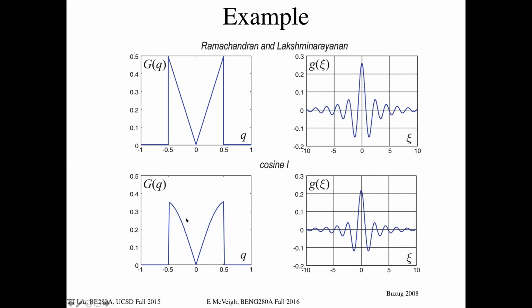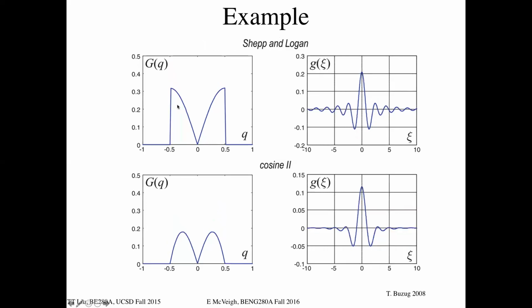However, to make the pictures look a little bit smoother, more appealing, oftentimes these high frequencies aren't amplified as much. You sacrifice some resolution, and you just tamp down the high frequencies. And the convolution kernel broadens, it's not as sharp, and these negative lobes are a little bit less, but you get a smoother, milkier looking image, right? And then this can keep going.